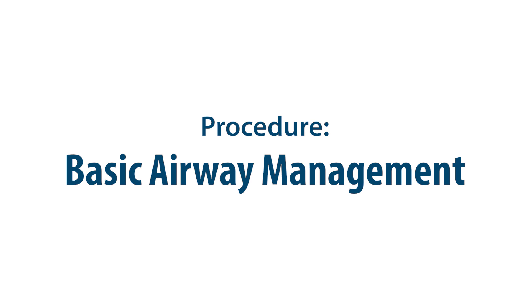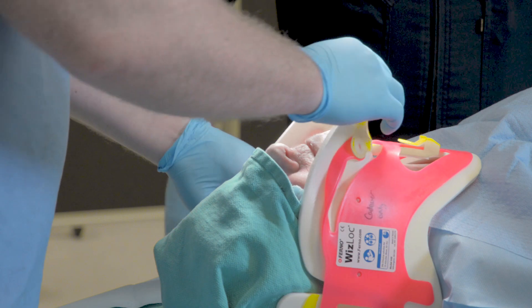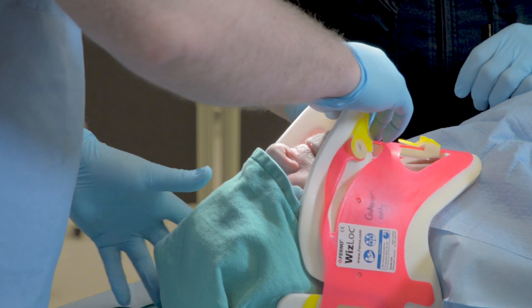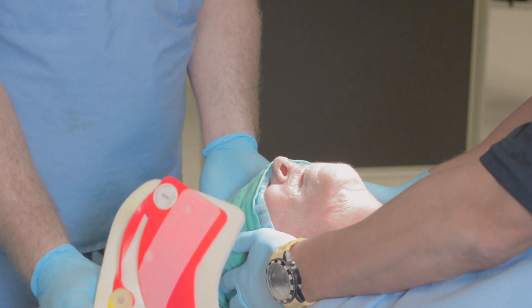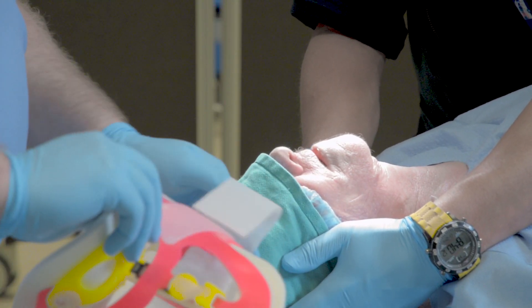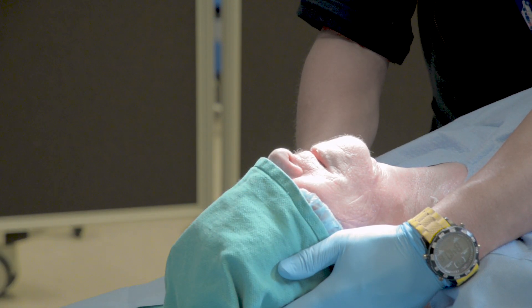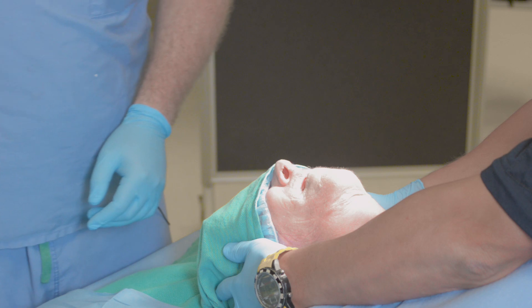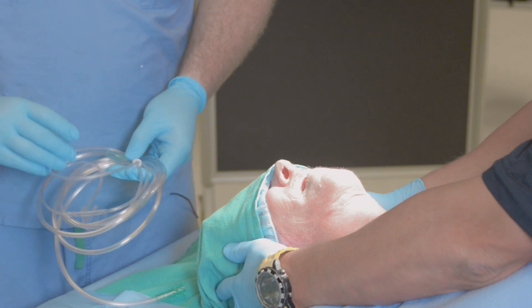For non-invasive oxygenation and ventilation in a traumatically injured patient, the first step is to open or remove the c-spine collar. We ensure that an assistant is holding inline stabilization, recognizing that the collar can cause soft tissue obstruction. We then follow the principles of the rule of twos — two sources of oxygen for all sick patients.